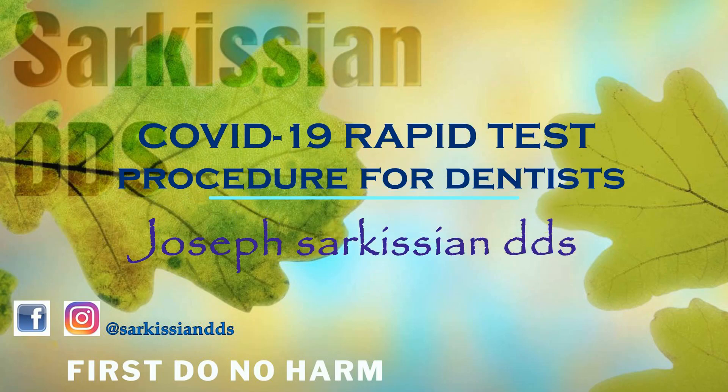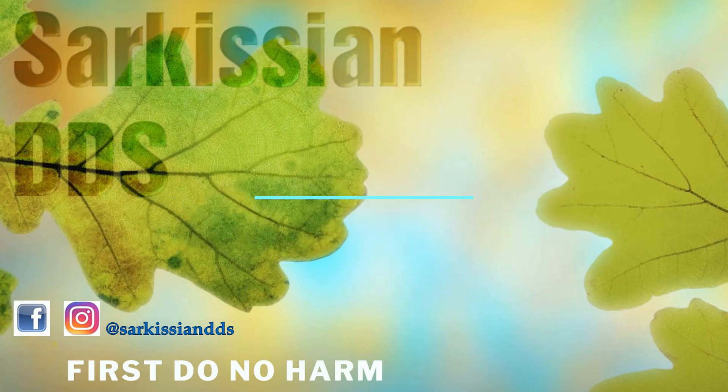In this video, I will briefly demonstrate the procedure for administering the COVID-19 rapid test. This test is a finger prick blood test, which measures antibodies to the COVID-19 virus.